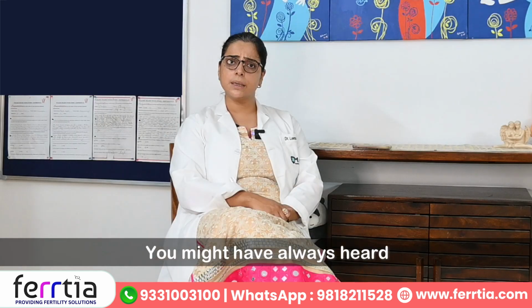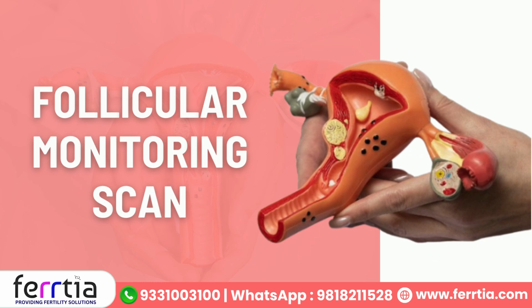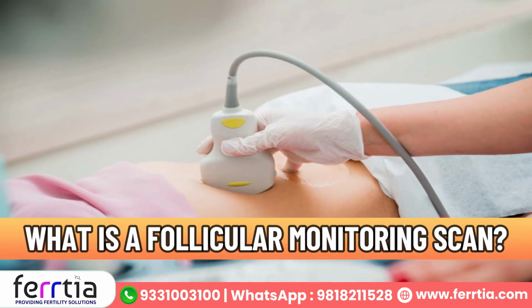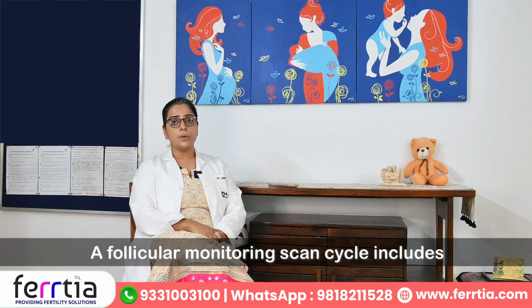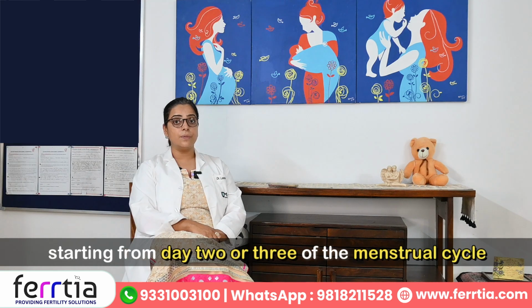You might have always heard that your doctor tells you that we will do a follicular monitoring scan. It is always advised on the prescription. So what is a follicular monitoring scan? What all do we see in that? And what is the significance of this scan? A follicular monitoring scan cycle includes 5 or 6 scans during a course of 15 to 18 days, starting from day 2 or 3 of the menstrual cycle.